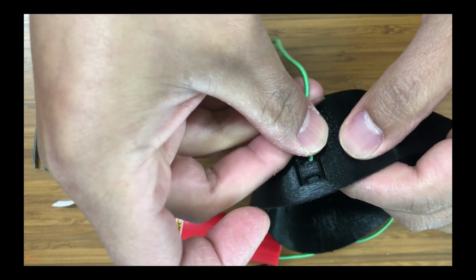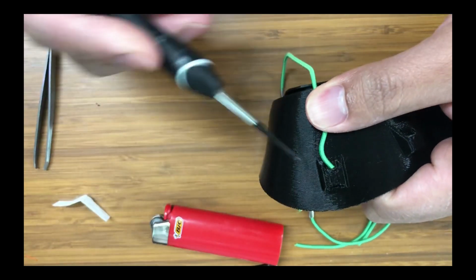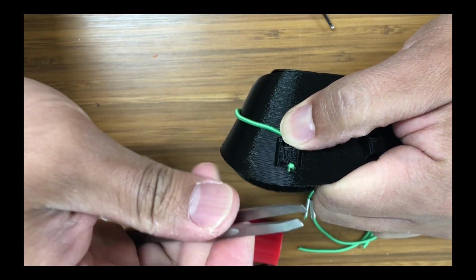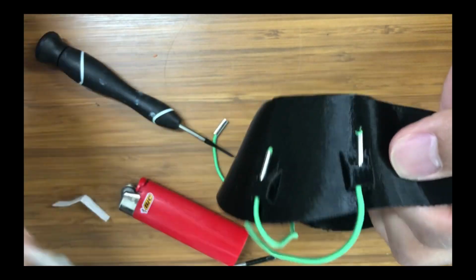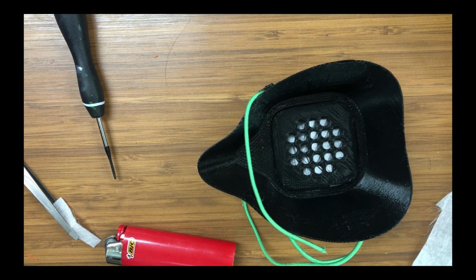We're gonna tuck it in. It's a little bit tricky because it wants to slip off, so I'm gonna use the assistance of a small flathead right here to kind of push it in. There you go. And once I have it peeking through like that, I'm going to get some tweezers and grab it and pull it all the way through. There you go. I'm going to repeat it for the other. Oh, it looks like one of my metal things fell off, so I'm going to get another hairband right here and install a new one.